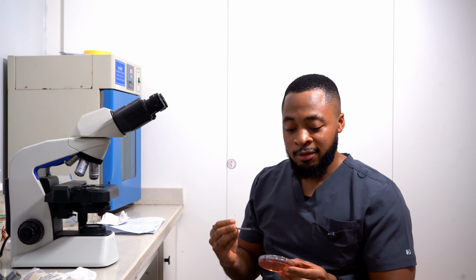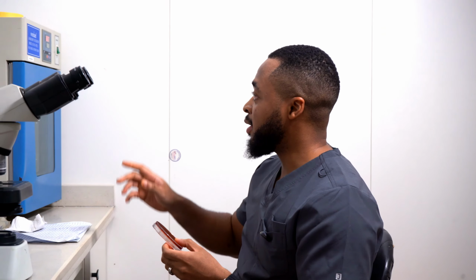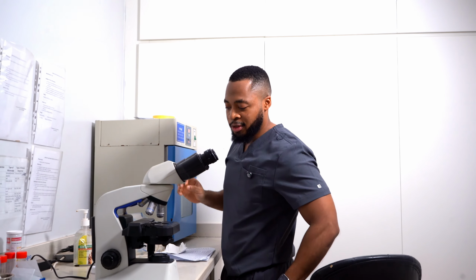So culture just basically means spreading your stool sample on this plate. After we've done that, we label it so we can be sure this is your sample. Then we put it into this incubator here and incubate it for 24 hours at 37 degrees Celsius. You may wonder why 37 degrees Celsius. There's a reason for this. That is the temperature that the salmonella grows in your body when you have typhoid fever. If you get it, fever, running a temperature, that's the environment that the salmonella tends to grow.